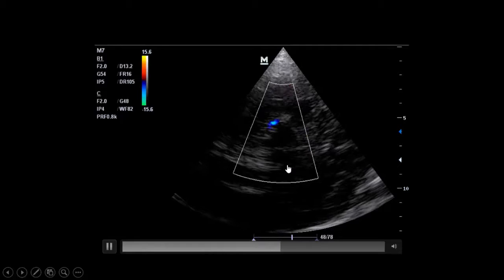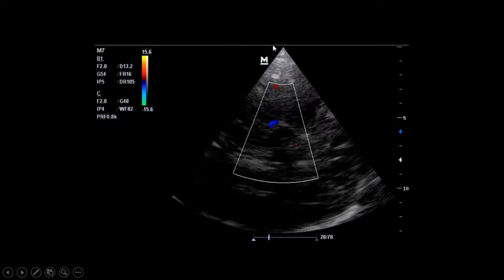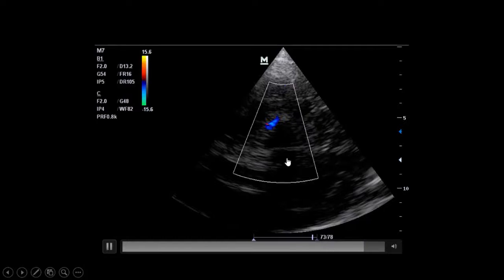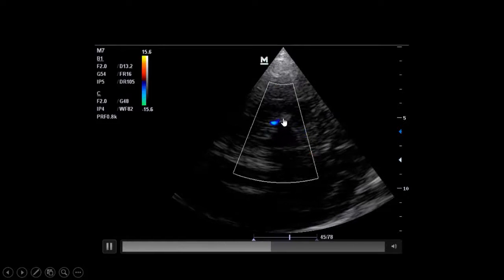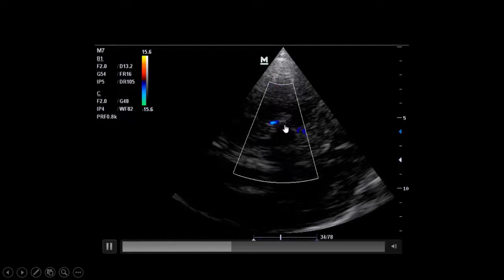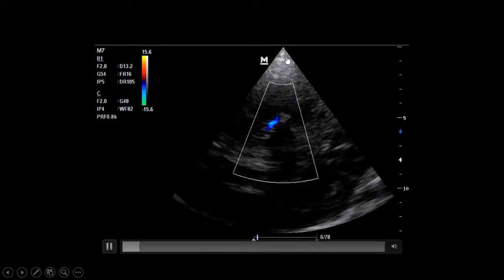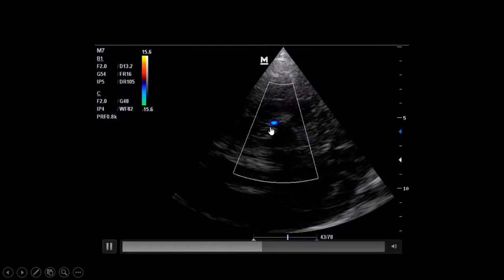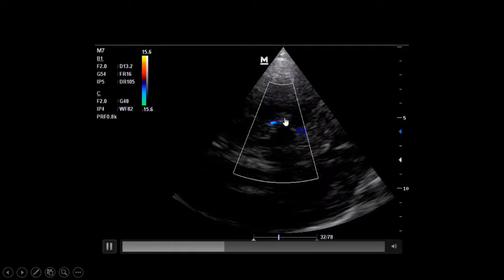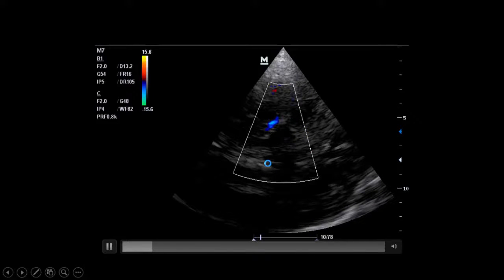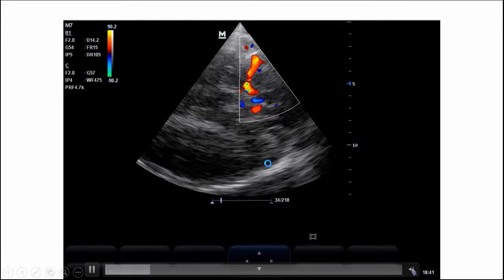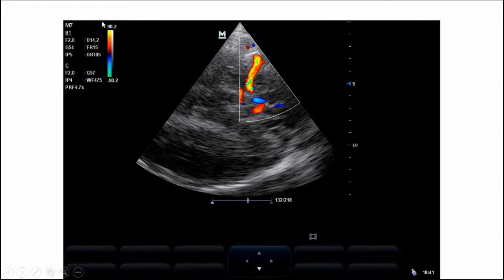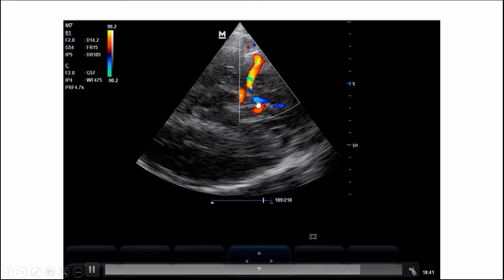Here is another right side view. The phased array probe is in the temporal region — posterior, anterior. Here is the beautiful hypoechoic brain stem area. The second part of the posterior cerebral artery curves around the midbrain, and in this second part it travels away from the probe, so it appears in blue — a marvelous, very clear view. You can also see the bone landmark. The butterfly landmark is very clear here, giving the complete story — the complete Circle of Willis.